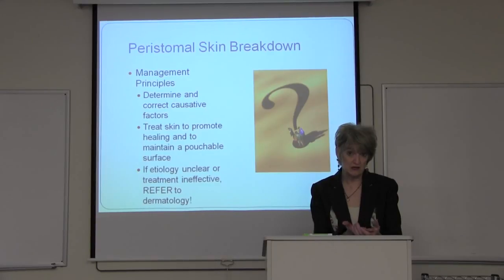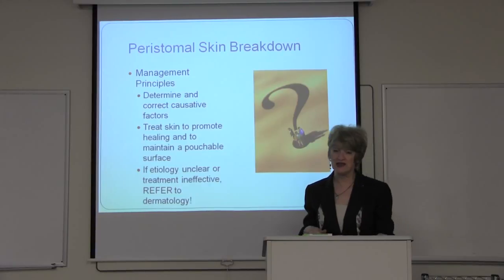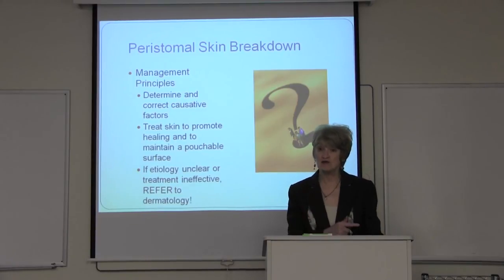We're going to talk about the most common types of peristomal skin breakdown, causative factors, what we can do to prevent, how we recognize and manage. Now, I can tell you that if a patient calls their physician and starts talking to their physician about a problem with their peristomal skin, he or she is almost always going to refer them to you.